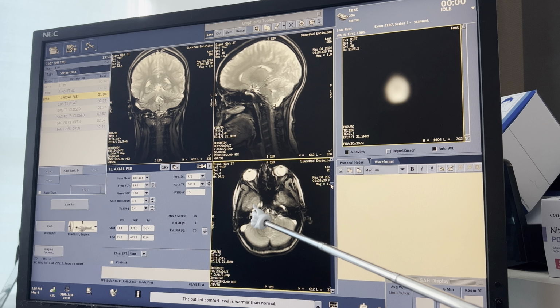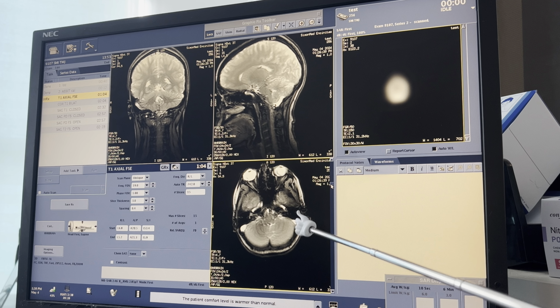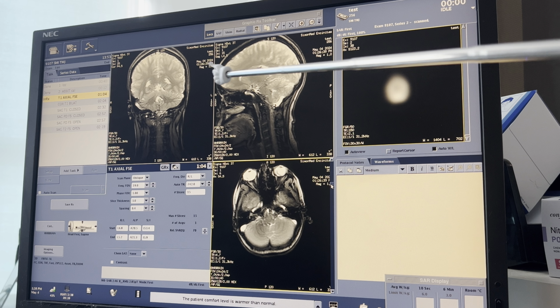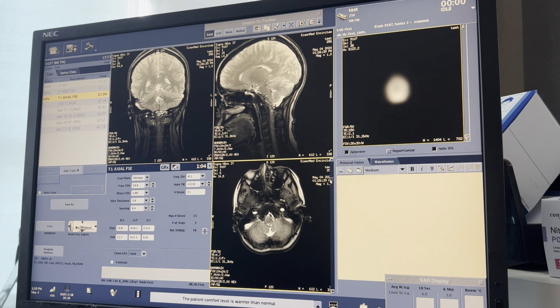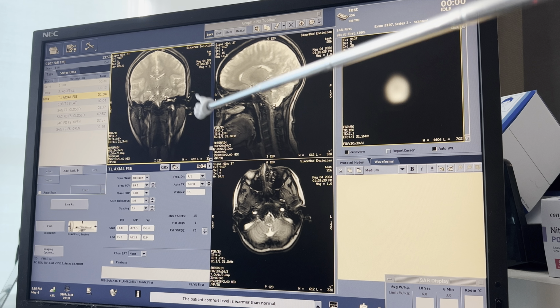You have Shrek's ears right here, which are the IACs, Shrek's head, shoulder, and chest and stuff like that. This is what I call Shrek. You can see the IACs are the ears. So let's over here find Shrek's ears. Scroll the other way. Perfect. Right there. Up one.